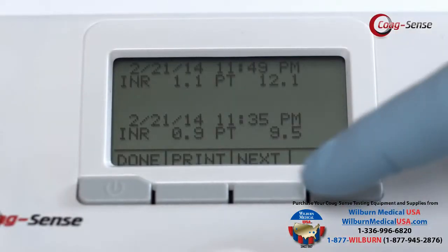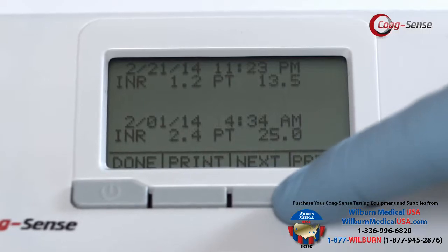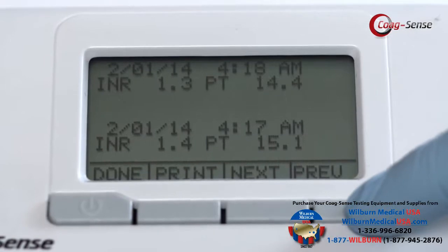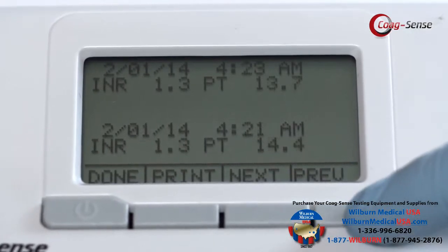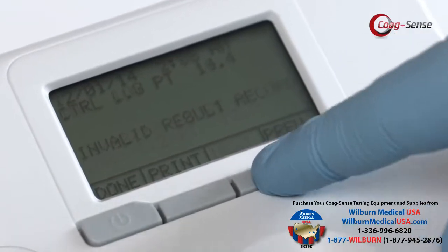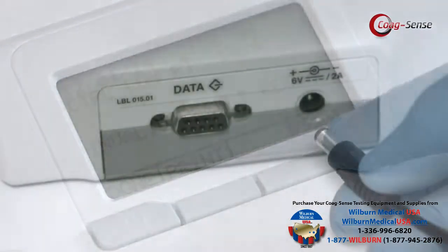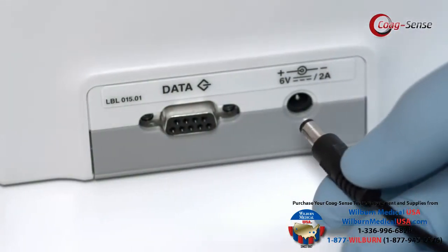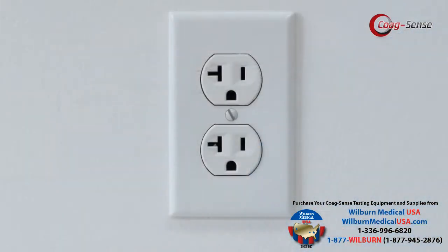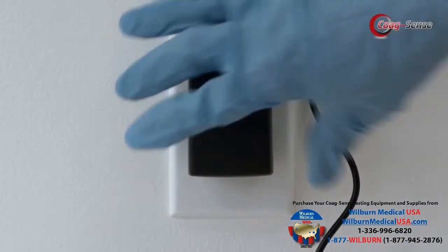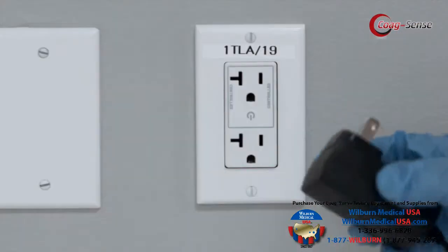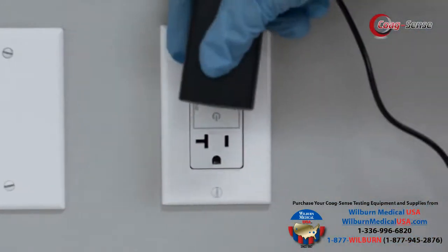The CoagSense meter stores the last 100 readings and automatically overwrites the oldest result. Each result is date and time stamped. The memory cannot be cleared, nor will readings in the memory be lost if there is a loss of power. On the back is a printer data port and the AC adapter port. If you are using the AC adapter, use only the CoagSense adapter by plugging into the adapter jack and a standard AC outlet.